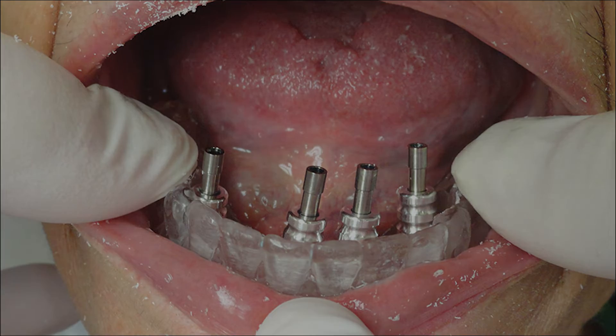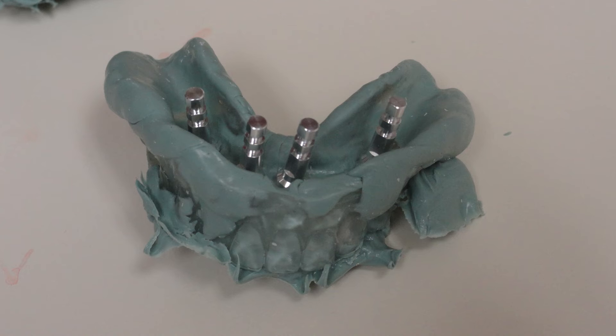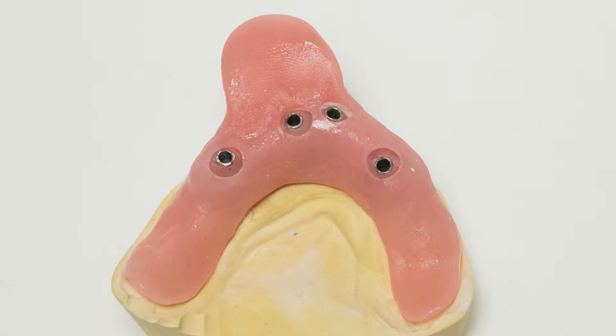Then take a VPS impression of the dentureless arch. Allow material to set completely. Loosen all screws and remove tray. Replace original prosthesis. Carefully check to see that all transfer copings are fully seated back into the impression. If a custom tray is needed, one can be provided to you for the next patient visit.